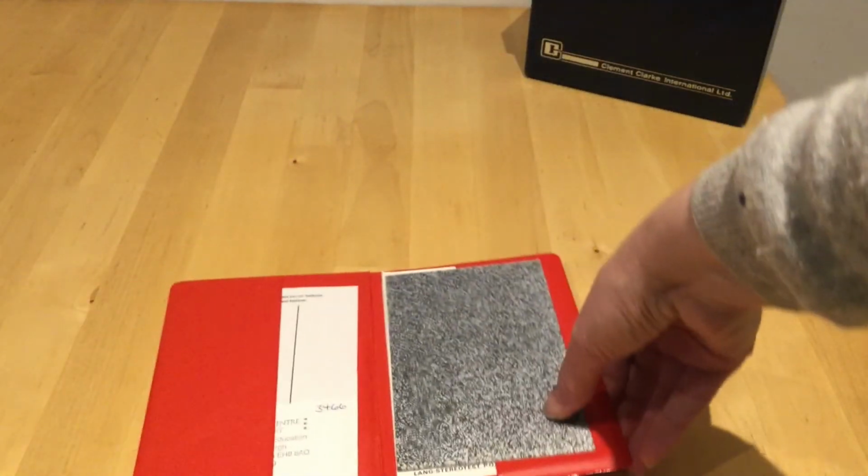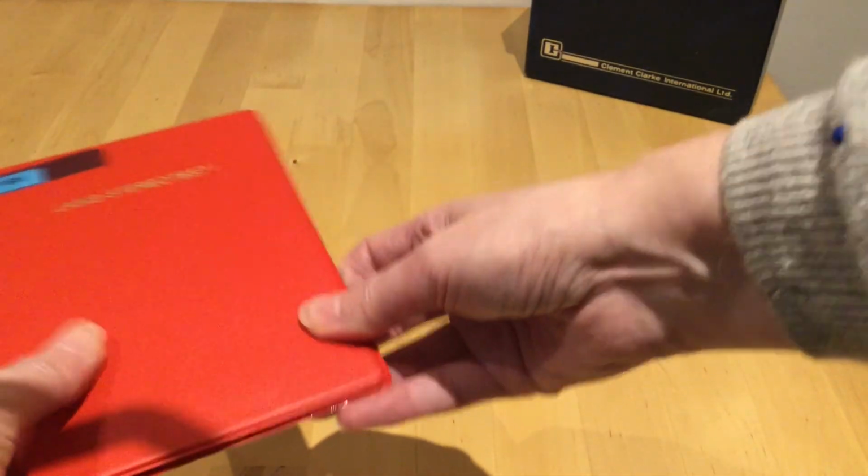You may have tests of stereo vision within your service. Remember, if the child's not got two eyes working together, then they are not going to have stereoscopic vision. So if they have a squint at all, then you will find that they are unable to do the tests.